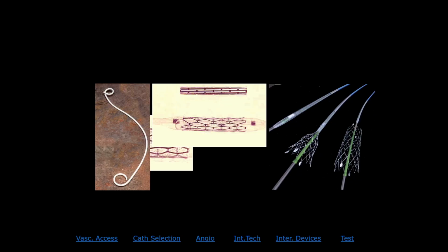Basically it is a staggered offset. You know how the bricks are laid for constructing a house. Something similar to that is the construction of this. So staggered offset. Here you have got one, the next one will start here only, in the middle of the other one.